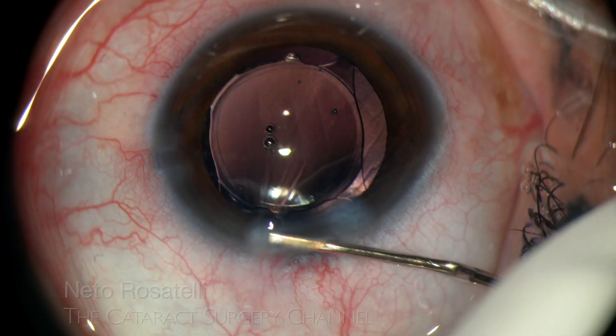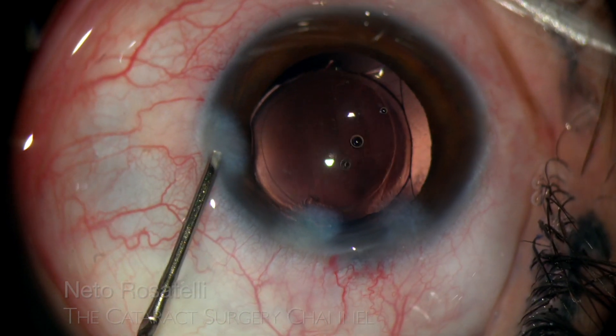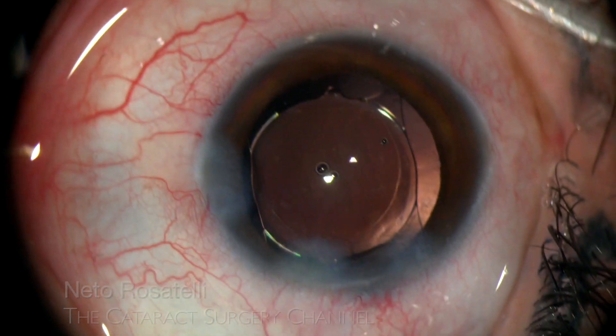It is remarkable how initially the rhexis seemed smallish, but in fact it really is 5mm in diameter, showing the usefulness of an engraved capsulorhexis forceps.